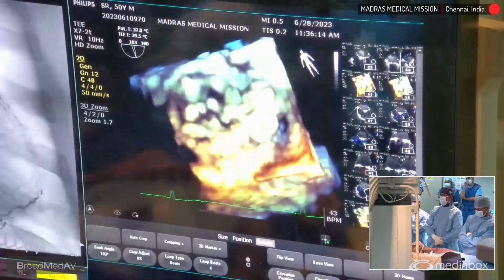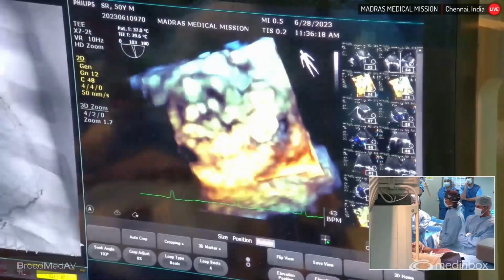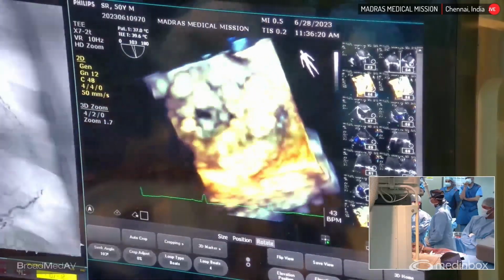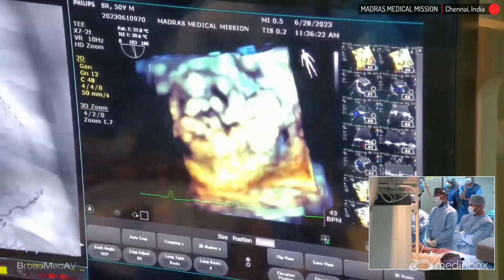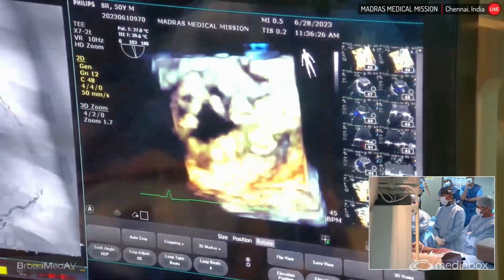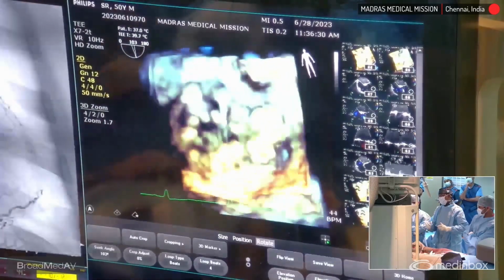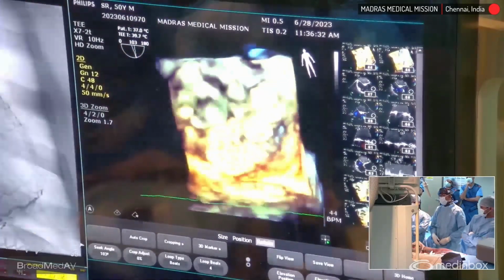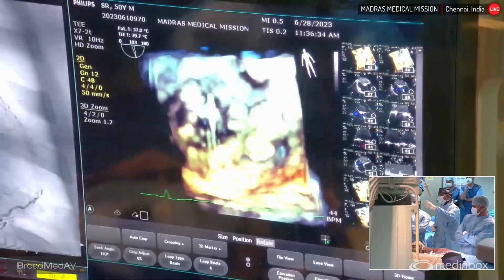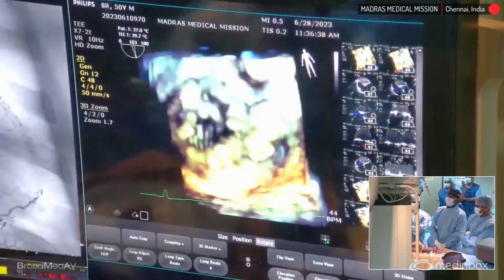This leak was originally looking a little crescentic or oval with a long axis dimension of around 11 to 12 and a short axis dimension of around 8. And so probably these two devices are plugging it in the appropriate position. In fact, now the 3D is also showing the valve leaflet mobility. The direction of movement of the valve leaflet is actually perpendicular to the devices. It's opening and closing in an anteroposterior plane.